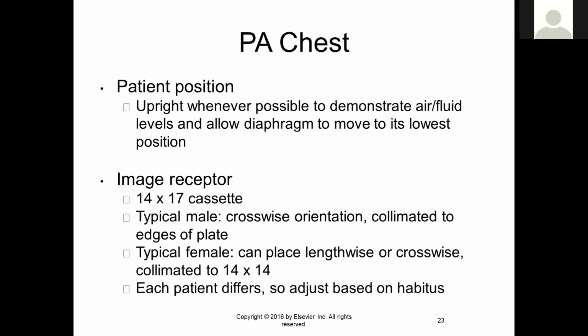Now, we do obtain these pictures on patients who are seated, either in a wheelchair or a hospital bed or a gurney, or even lying on their back on the table. But whenever possible, we want our patients upright. Not every patient can safely stand, so we have ways of getting around that. We're going to put safety first, but if your patient can stand, if they're not dizzy, we're going to have them upright for a PA chest projection.